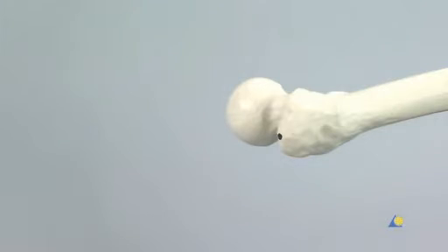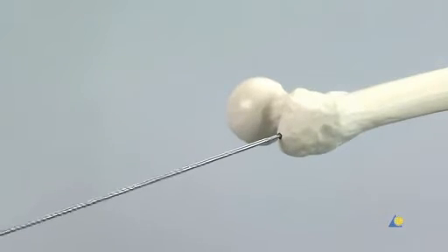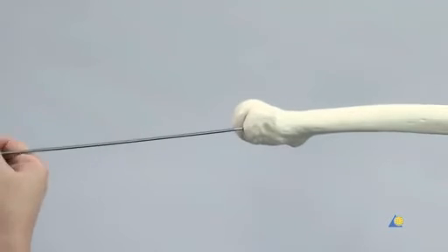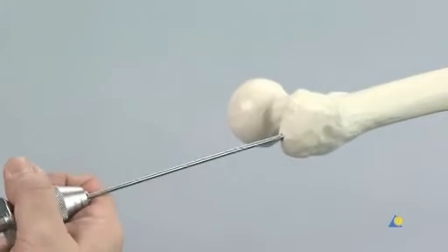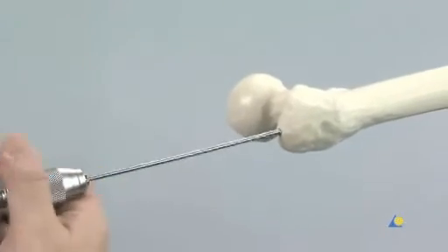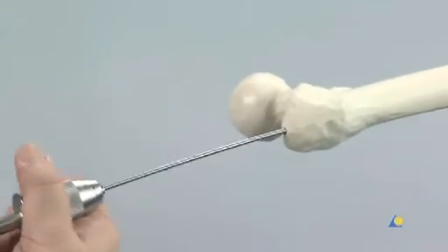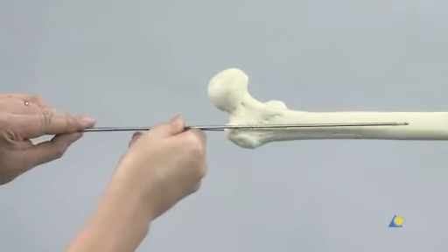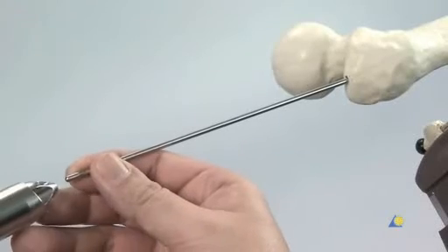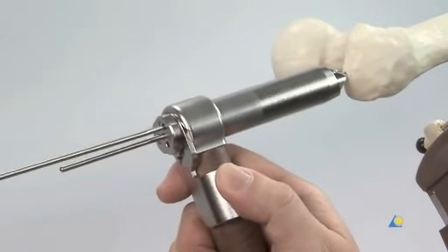The 3.2mm guide wire mounted in the universal chuck with T-handle is inserted into the tip of the greater trochanter. In the lateral view, the guide wire must be on the longitudinal axis of the femur and centred in the medullary cavity. Any other position will place the guide wire too dorsally or too ventrally, hindering smooth introduction of the nail. In younger patients with strong bone, it might be necessary to use a power tool to insert the guide wire. To check insertion depth, a second guide wire can be laid alongside the first. If the position is incorrect, the multi-hole drill sleeve can be used to insert a second guide wire in a better position.